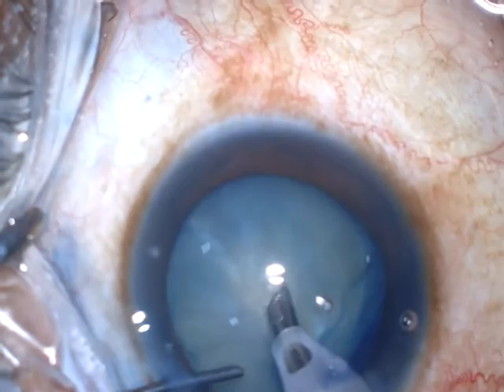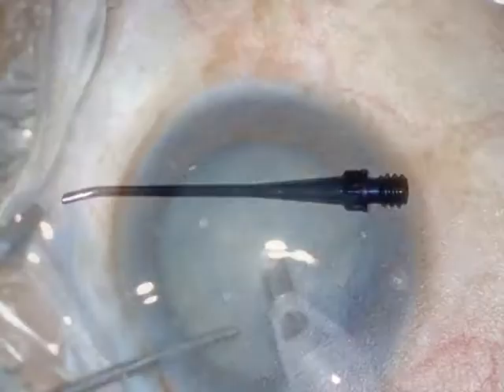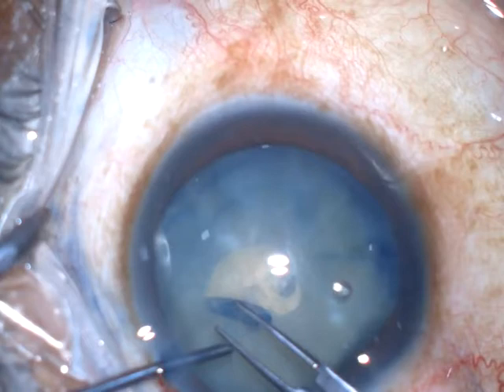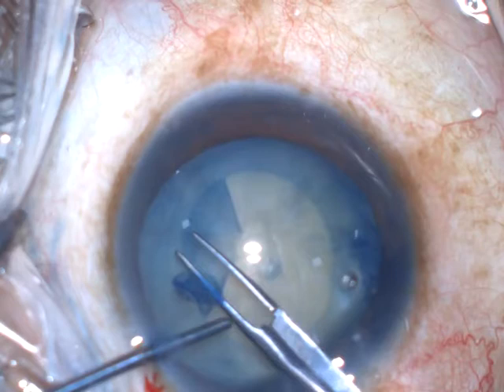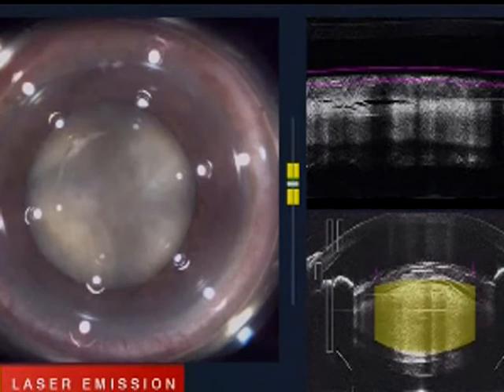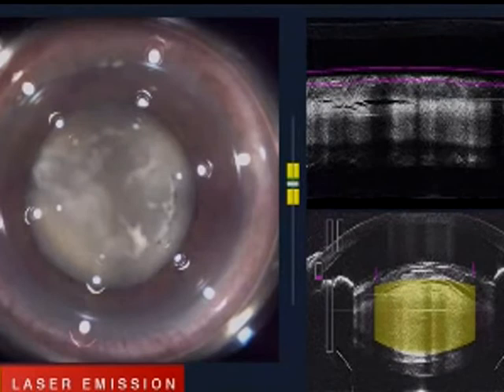The punch can be made with a Kelman or any other bent tip, but is preferably done with a straight tip, which is easier with a shorter learning curve. The precision of a femto rhexis — which not all surgeons can afford — to achieve a perfect rhexis in a hypermature cataract can be successfully achieved with panchorexis.